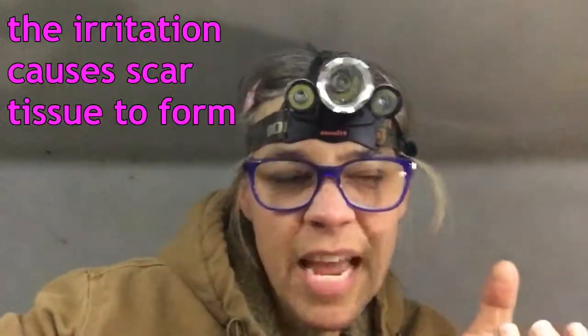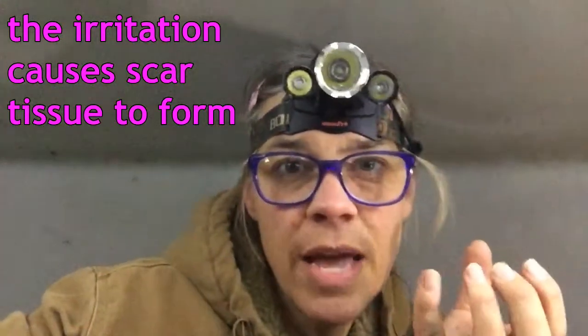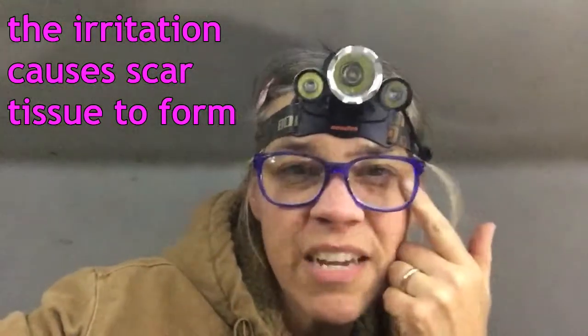But if you start with penicillin, it's kind of nice because the penicillin irritates the tissues underneath this area, and it'll actually stiffen it up. So the actual pressure of the penicillin rolls the eyelashes off the eyeball, and then the irritation of the penicillin in that tissue causes it to get stiffer, so it holds it that way when it finally absorbs the penicillin. So this is the little baby goat that we're going to do.